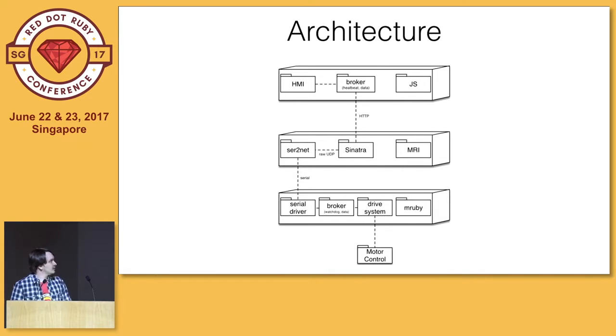To go a little bit more into detail on the architecture, I have the motor controller at the very bottom. I wrote the drive system as some kind of broker. That's maybe because of my background in signaling systems. I was a little bit afraid of what happens if I have a bug with an endless loop and the wheelchair just accelerates. So honestly, I over-engineered a little bit at the beginning, because I wanted an automatic braking system if I do not get any controls anymore.